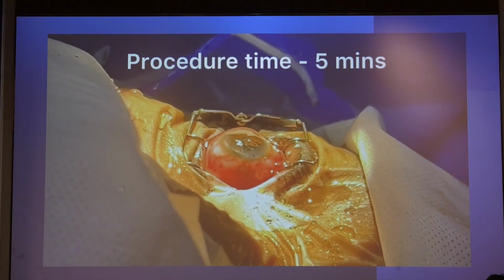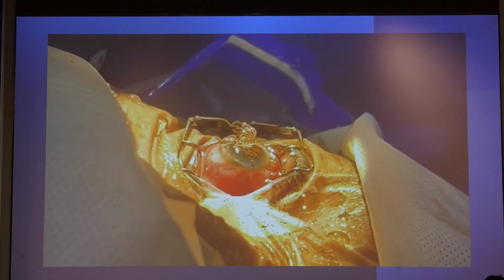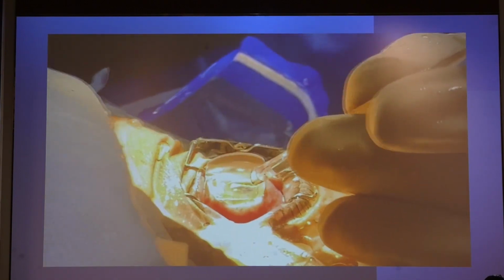Another thing is you should see some blood reflux coming out after you insert the device, so you are sure that you are in the right place. And when you do, you can see, I'm just showing it again, and you can see that the snorkel is facing towards you, and you can see some blood oozing out. So that says that you're in a perfect plane.